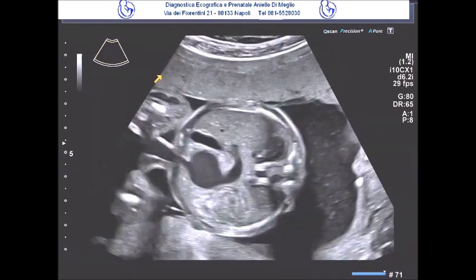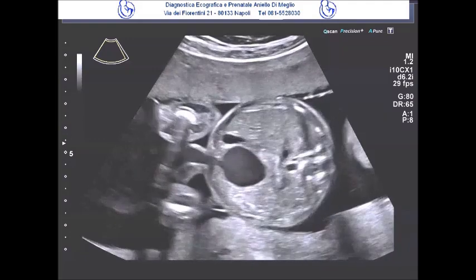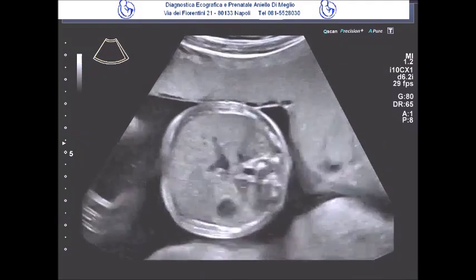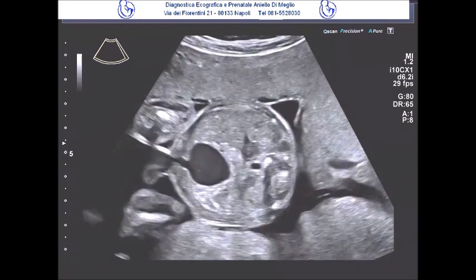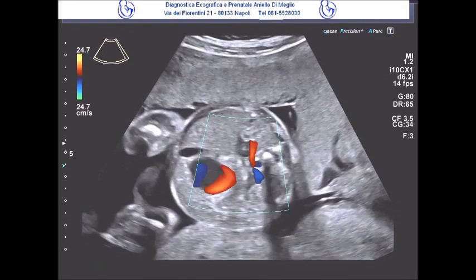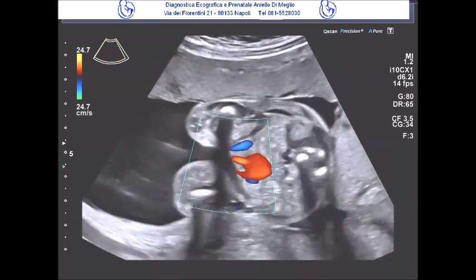We then continue to observe what appears to be a cyst-like formation, which, as we can see, is continuous with the vascular axis or with the cord structure. The cord insertion is normal, and we can actually see a regular, normal intestinal mass. The gallbladder is on the right. The formation is located at the intra-abdominal elbow and measures approximately 17 by 16 millimeters. It can be distinguished from hepatic cysts, as it is not actually located within the hepatic parenchyma.